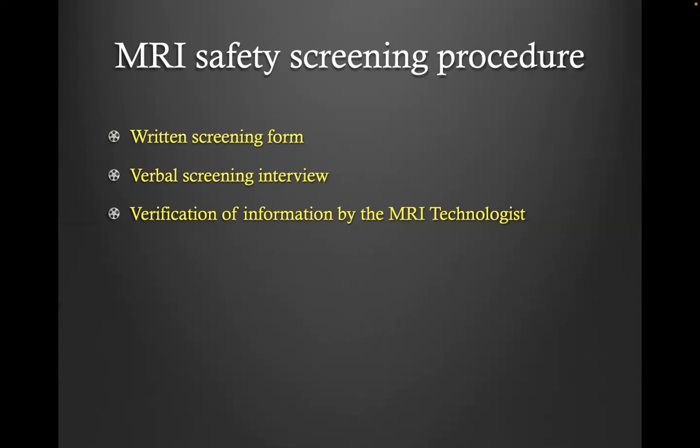And our MRI technologists are going to go through the checklist with your patient again as a third level of protection. And there are cases where our technologists will deem that something is insufficient and they cannot do MRI, and then they will turn you away. That's why it's extremely important to contact us if there's anything uncertain on the MRI checklist.